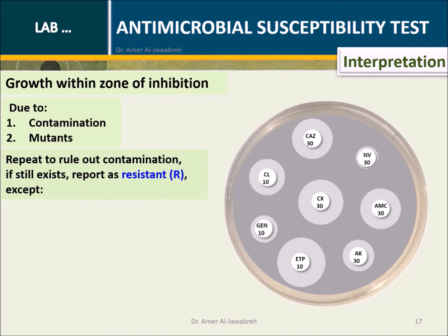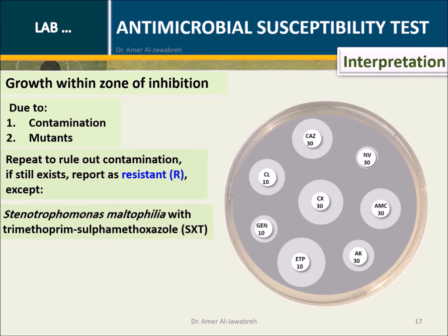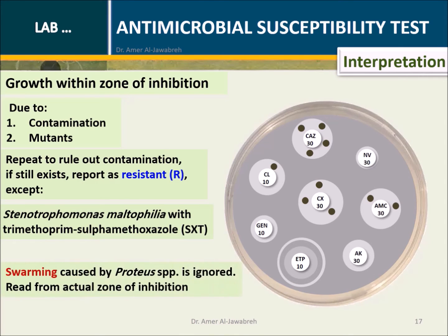If growth is observed within the zone of inhibition, this may be due to contamination or mutants — repeat to rule out contamination. If it still exists, report as resistant. Note: Stenotrophomonas maltophilia is reported with SXT. Swarming caused by Proteus species is ignored; read from the actual zone of inhibition.